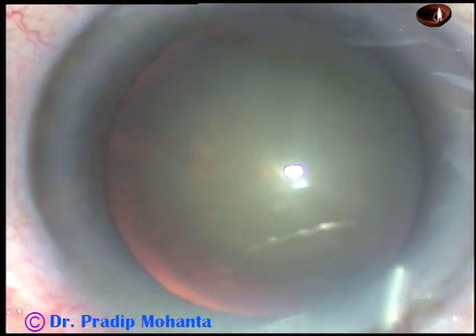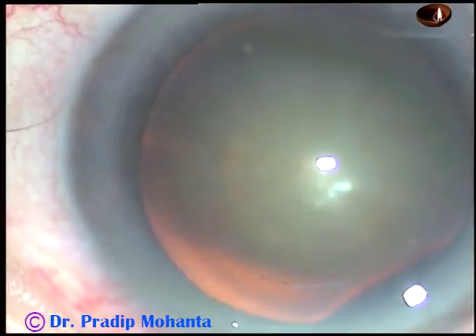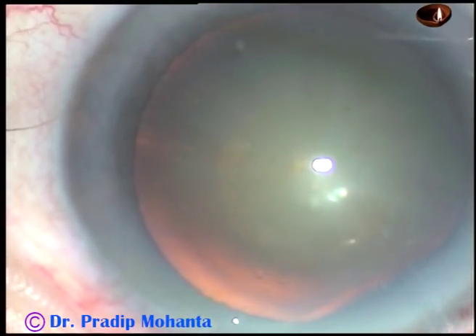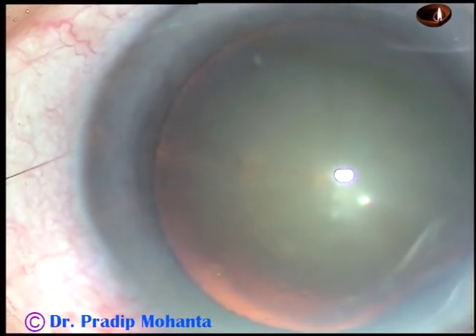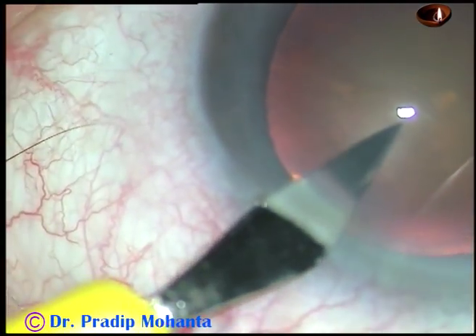By this time, the main incision has been placed at a selected site. Viscoelastic substance — 2% hydroxypropyl methylcellulose — has been injected into the anterior chamber. Now, this is a paracentesis on the left side of the main incision.